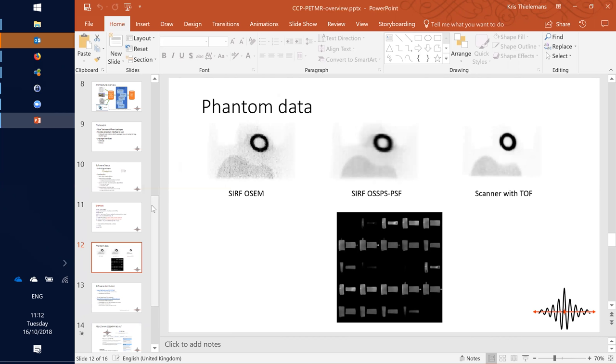For the moment in CASToR, as we started not very long ago, we only have the reconstruction command line. We are starting to make it more like a library, so that you can use just one piece or another. But for the moment, it's very far from the possibilities that you have with STIR, where you can just call one component or another. A lot of effort should be made to do that. Right, so as you said, for the moment it's more like just calling a reconstruction. Yeah, it's not possible for the moment to use one component or another. Okay, we are too far from that.